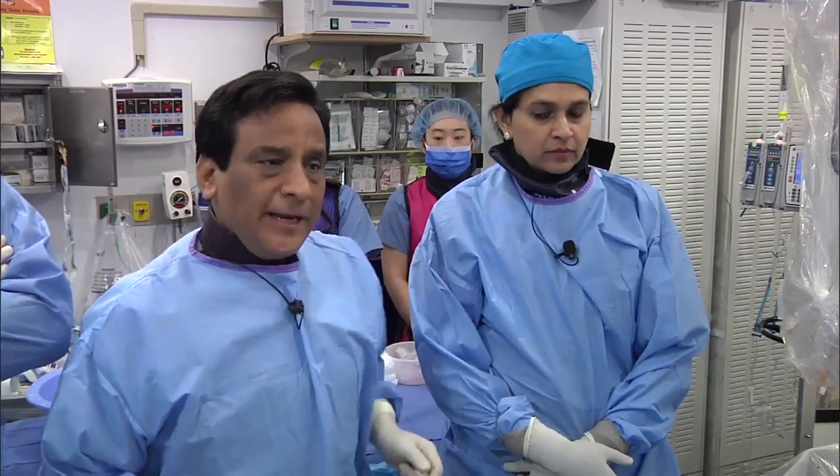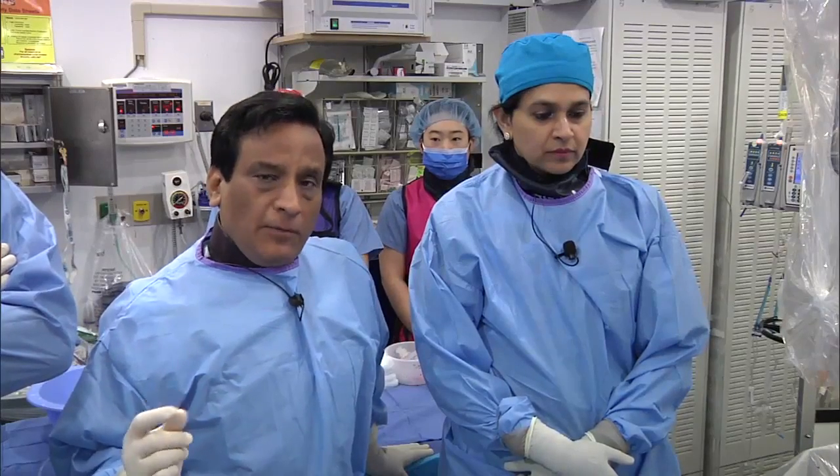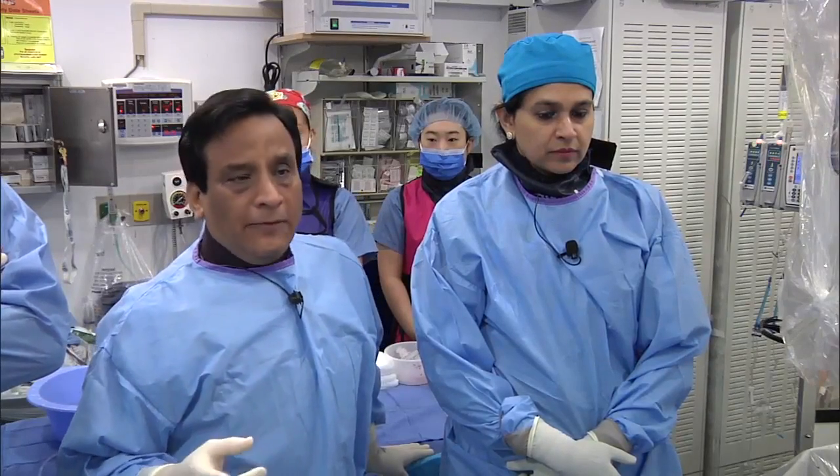The fourth case was a real highlight: a very tortuous shepherd crook calcific right coronary with a distal lesion, about 80-90% calcium. There was a lot of debate whether that patient should get a rotablation. Masterfully, skillfully, Annu demonstrated the use of the guideliner, using two wires through the six French guideliner, and the ability to deliver a stent in that shepherd crook complex calcific right coronary artery.